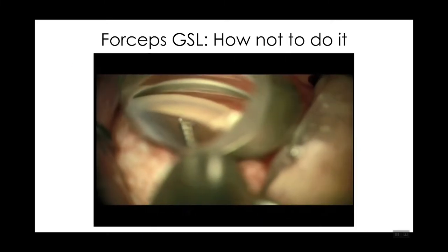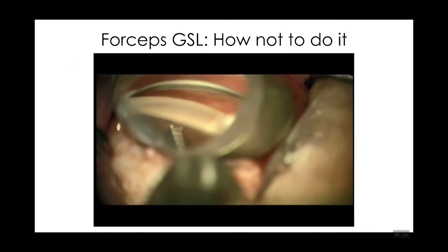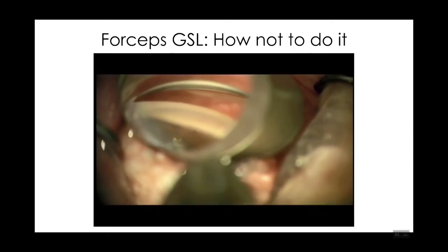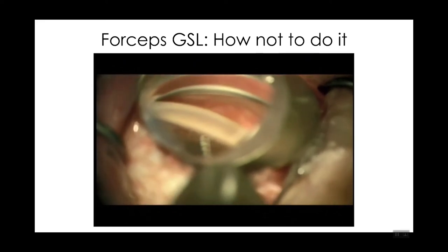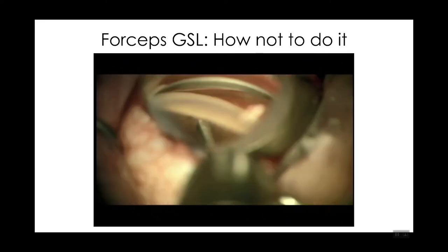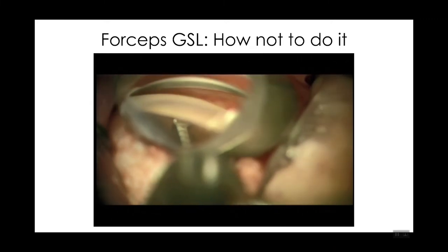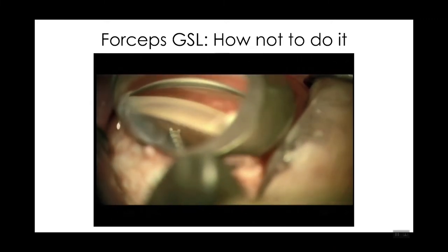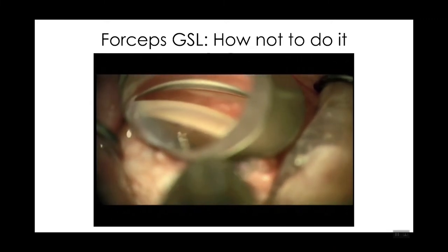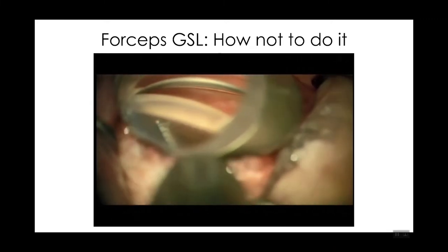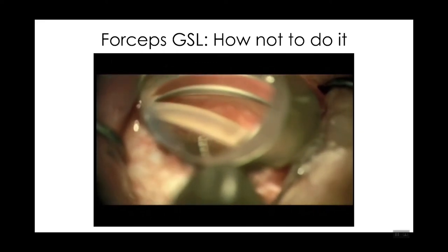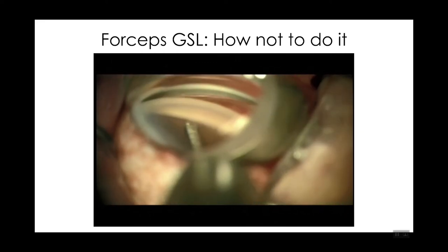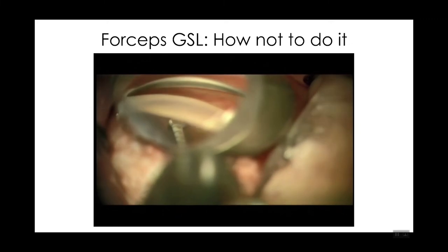Here's an example of how not to do GSL with forceps. What we're seeing is an incomplete grab of the periphery of the iris and releasing the iris prior to separation of the PAS. This shows the importance of committing to the tissue once you grab it and pulling down away from the trabecular meshwork.